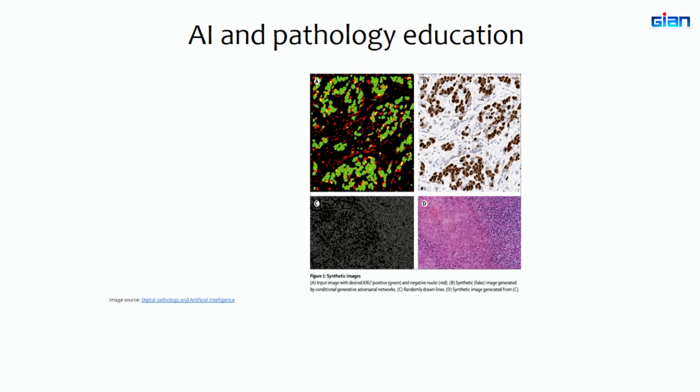Then pathology education. One of the ways of using digital pathology for education, like I said, is when there is a group of medical students doing a pathology rotation. The pathologist would want them to understand that there's a particular image, and certain parts of the image have certain diseases. So they can digitize it, put it up on the screen, and show them what the different parts of the image are.